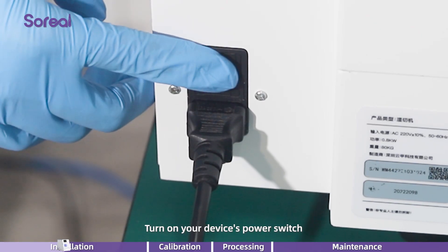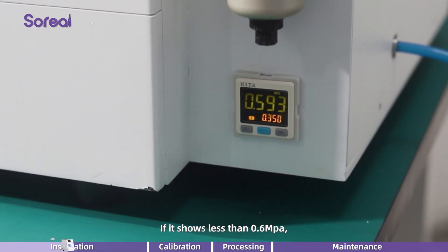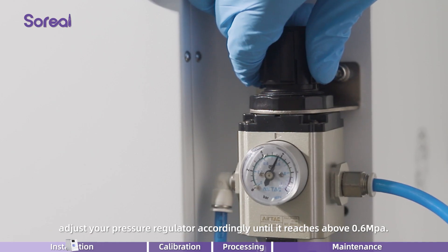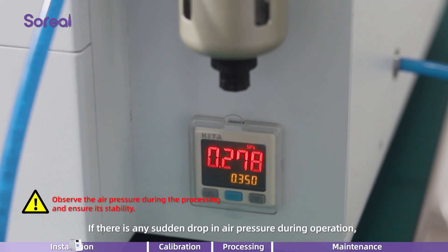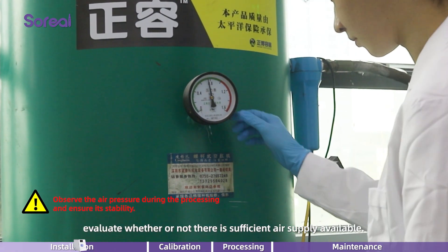Turn on your device's power switch and check its air pressure gauge. If it shows less than 0.6 MPa, adjust your pressure regulator accordingly until it reaches above 0.6 MPa. If there is any sudden drop in air pressure during operation, evaluate whether or not there is sufficient air supply available.